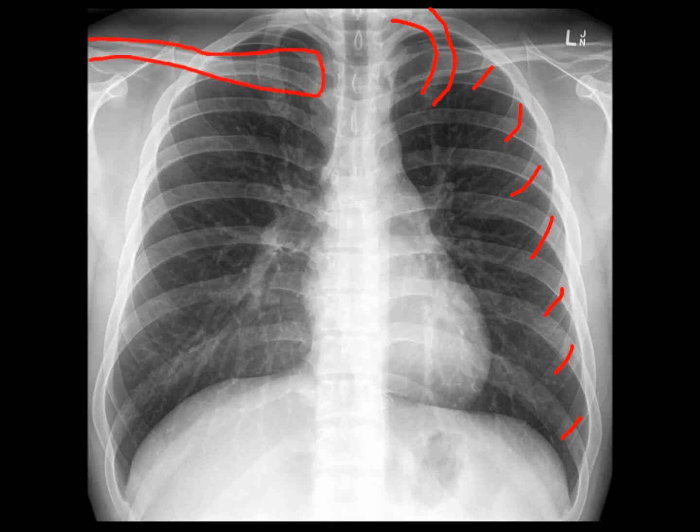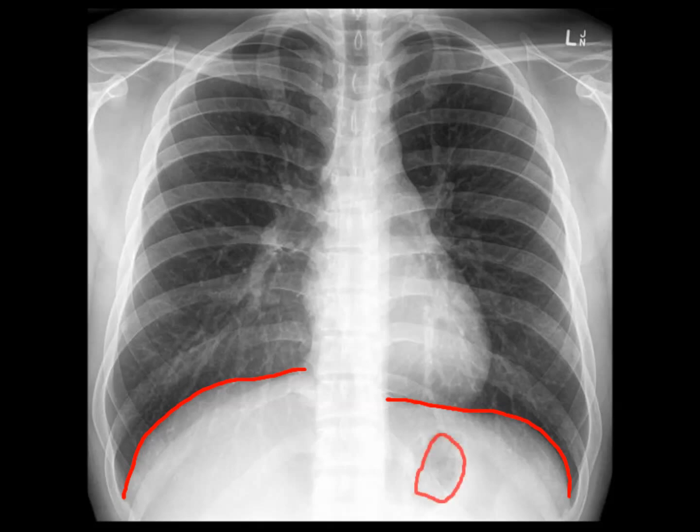The next bit outlined is the right clavicle. The borders of the diaphragm are outlined here. Notice that the right hemidiaphragm is higher than the left — this is normal and is due to the liver lying underneath. On the left side, you might see a bubble under the diaphragm: this is a gastric bubble in the stomach and is a normal finding.